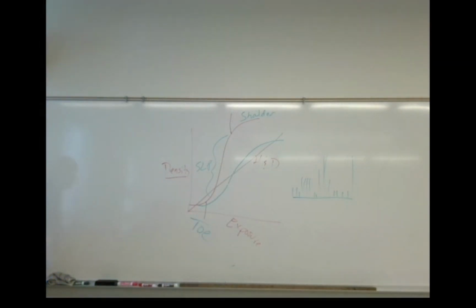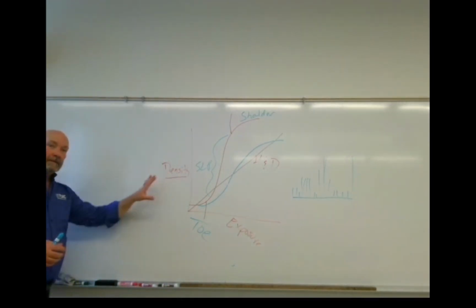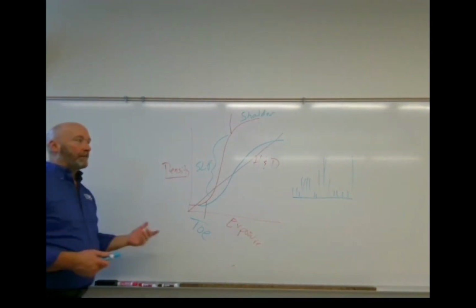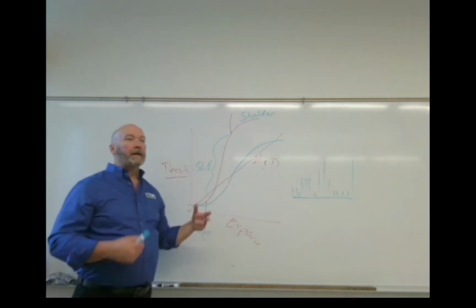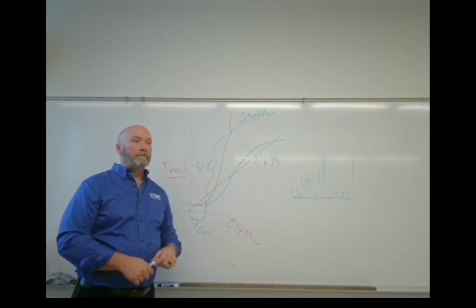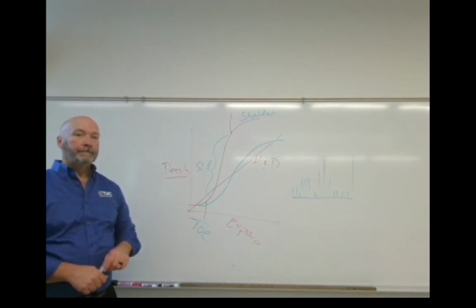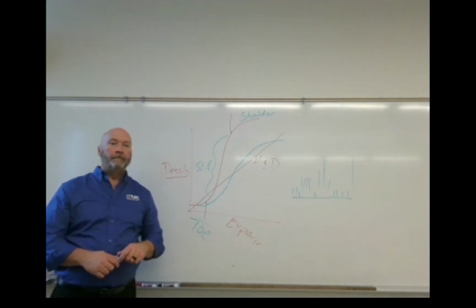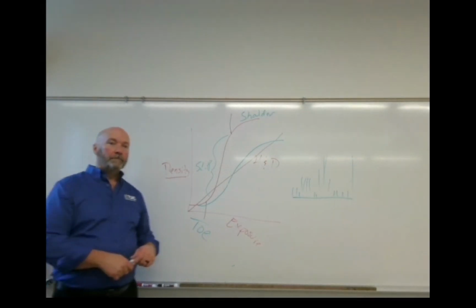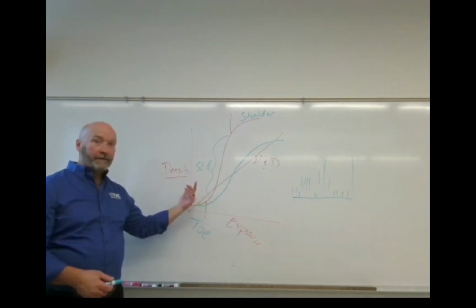Any questions? So on the test, is it going to ask, what's the best control of contrast? The answer would be H&D curve? No. In context of the H&D curve, what I might ask is which one of these two is inherently higher contrast? Okay. This one. But you're not measuring contrast. No. It's which one has more contrast, which one is better for low contrast. Which one's faster, maybe?